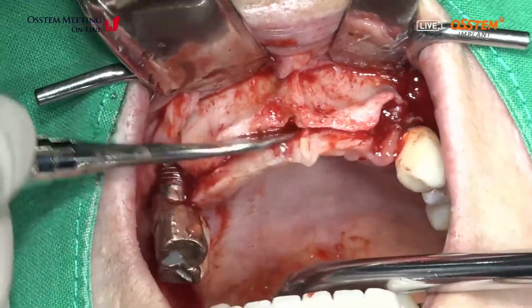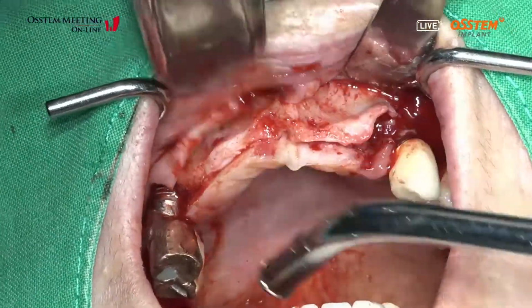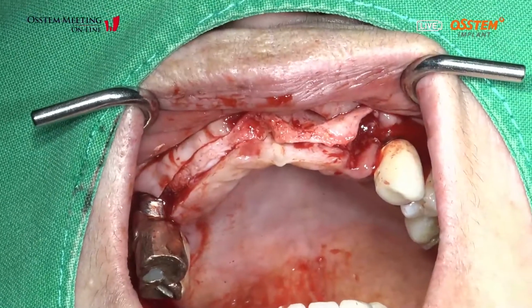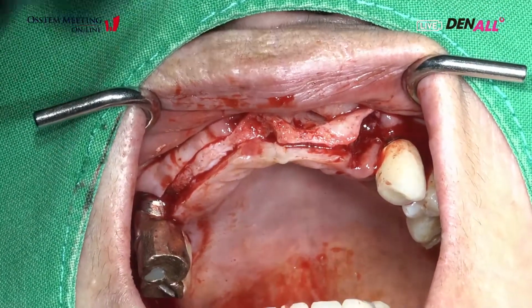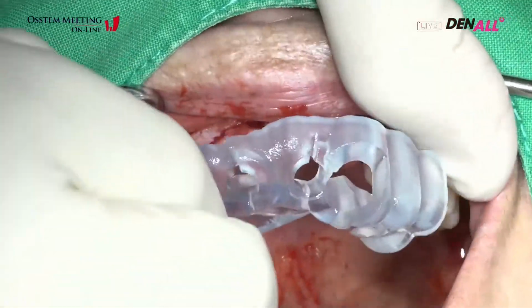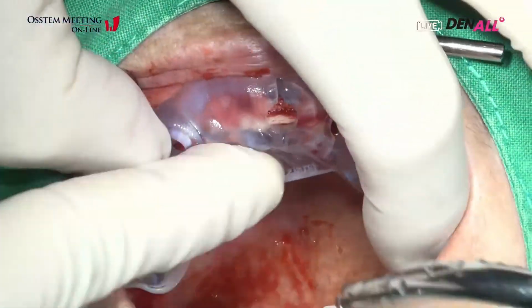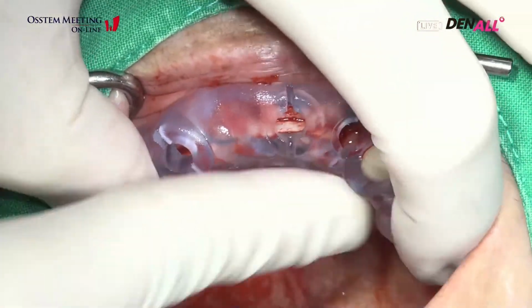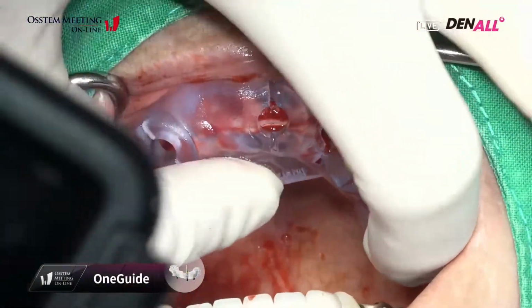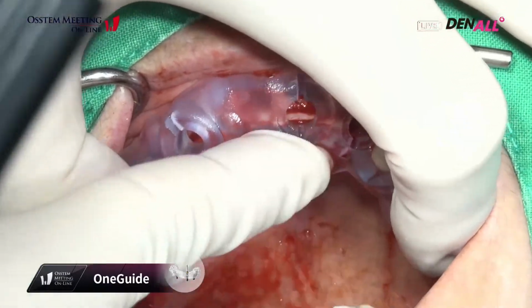OneGuide template. So, to place implant in ideal position and angulation, I will use this OneGuide template. This OneGuide template will be supported by adjacent implant prosthesis, so I could open the flap.